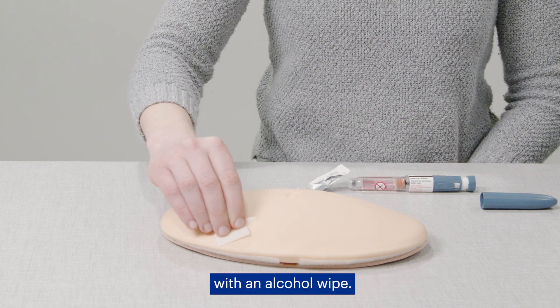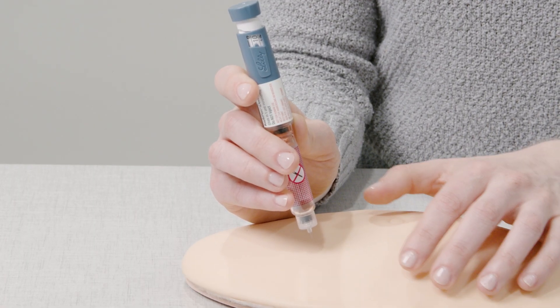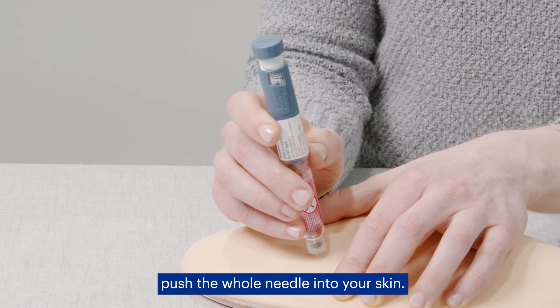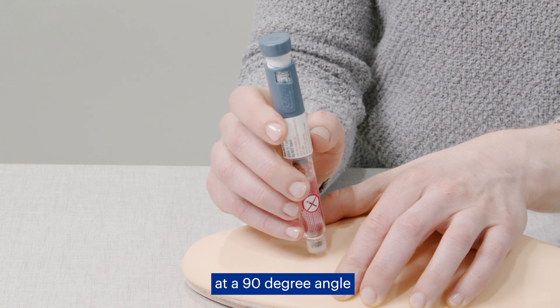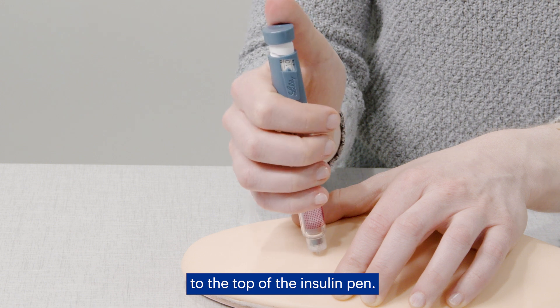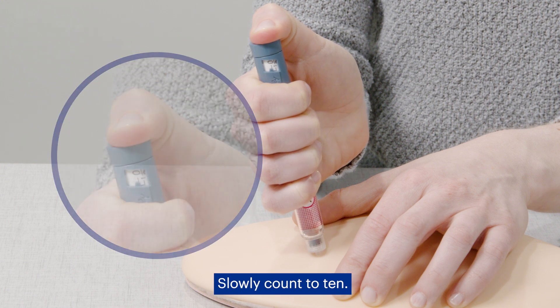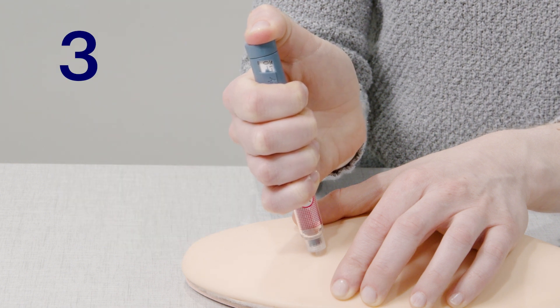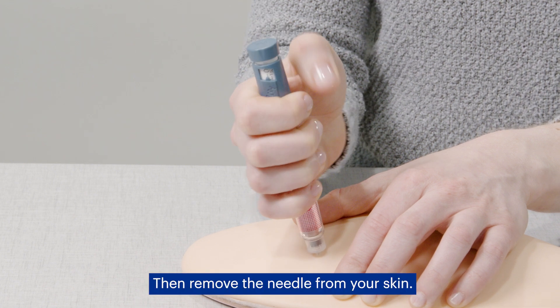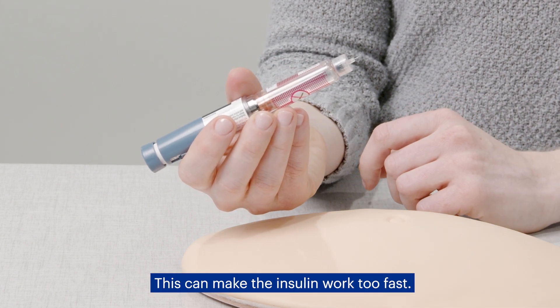Gently clean the skin with an alcohol wipe. Hold your insulin pen in your fist with your thumb on the side of the pen. Gently pinch your skin at the injection site. In one motion, push the whole needle into your skin, making sure the needle is inserted at a 90-degree angle to the injection site. Move your thumb to the top of the insulin pen, hold the pen stable, and push the injection button down gently until it returns to zero. Slowly count to 10, then remove the needle from your skin. Never rub the injection site after the injection, as this can make the insulin work too fast.